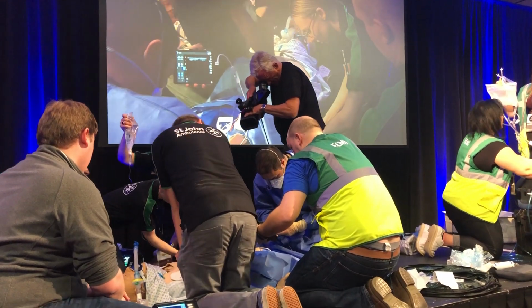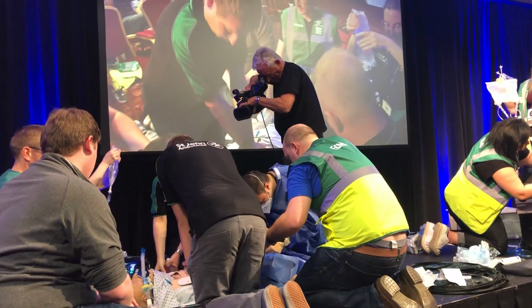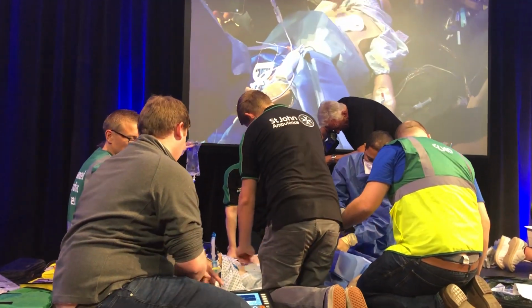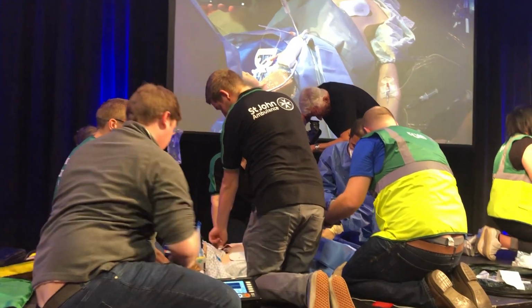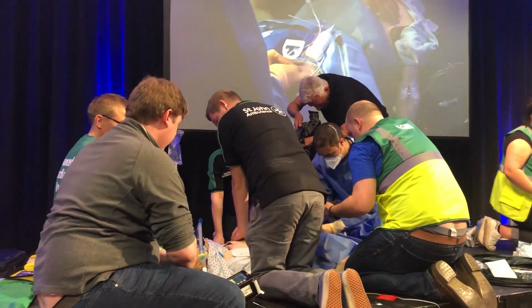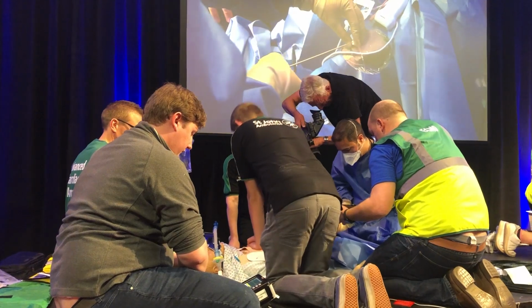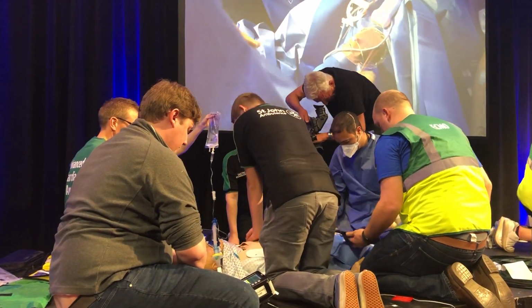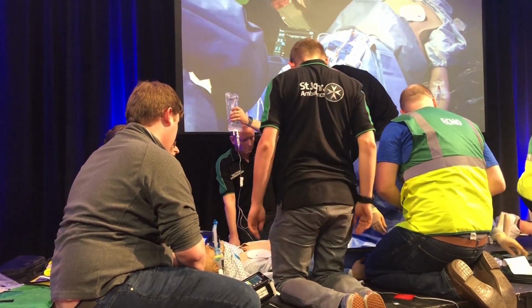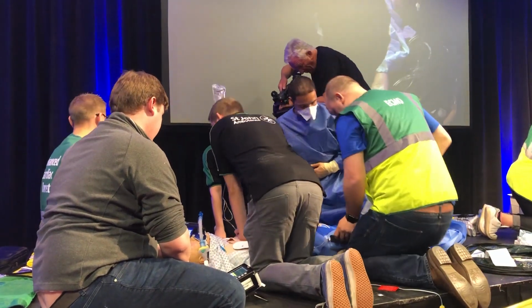So Simon, who's leading the cardiac arrest, will also be starting to think about some of the inclusion criteria. He'll start to think about whether they hit the age. He'll be really interested in the end-tidal CO2. If you have 1.5 kilopascals or less after 20 minutes of CPR, you might as well stop. There's very strong evidence that end-tidal CO2 doesn't predict success, but it does predict failure. If the end-tidal CO2 is low at 20 minutes, universally the outcome is poor.